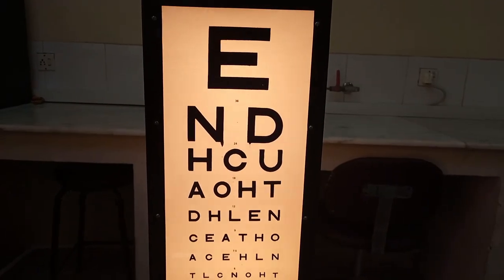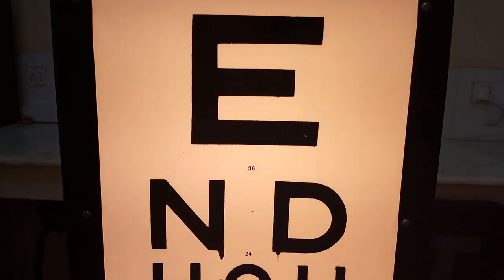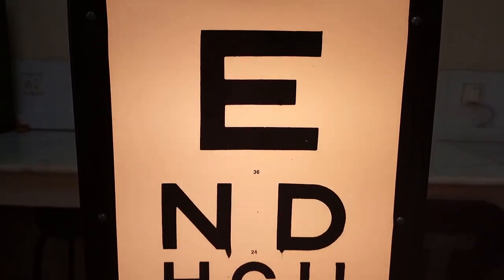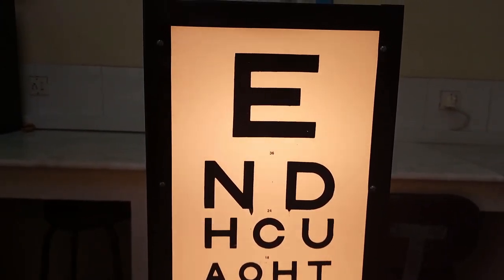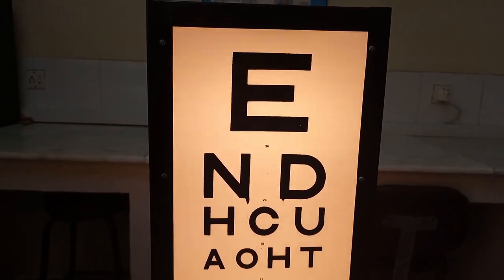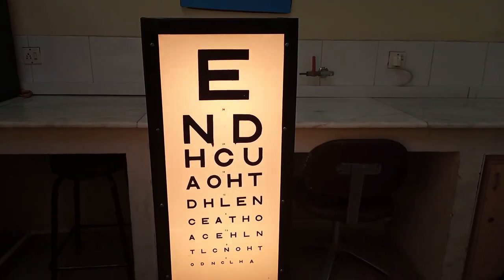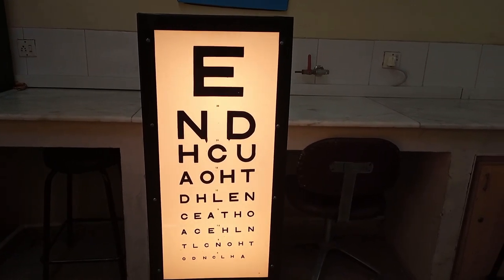If the person is unable to read even the top line, you ask him or her to decrease the distance. The distance between the person and the chart can be decreased by 1 meter. Still, if he or she cannot read the top line, you can keep on decreasing the distance by 2 meters, 3 meters, until he or she is able to see it. If still at a distance of 0.5 meter, he or she is unable to see the top line, then you will ask him or her to count your fingers at a distance of arm length.